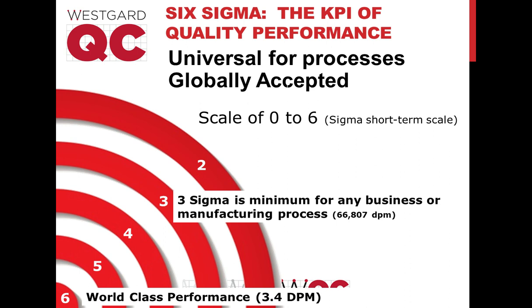You might decide to run your QC and set your rules just based on the worst case scenario, or you might decide to do it on the best case scenario, or somewhere in the middle. What we encourage is to define the critical decision levels, the medical decision level where diagnoses are being made or patient outcomes are most impacted, and fix your sigma around that.